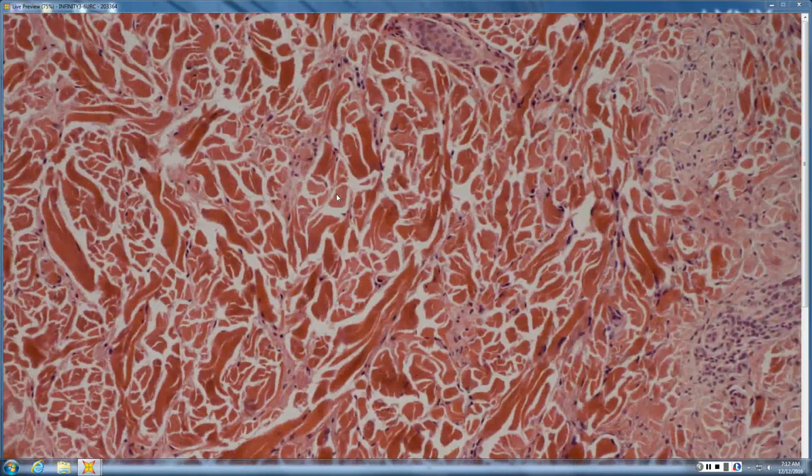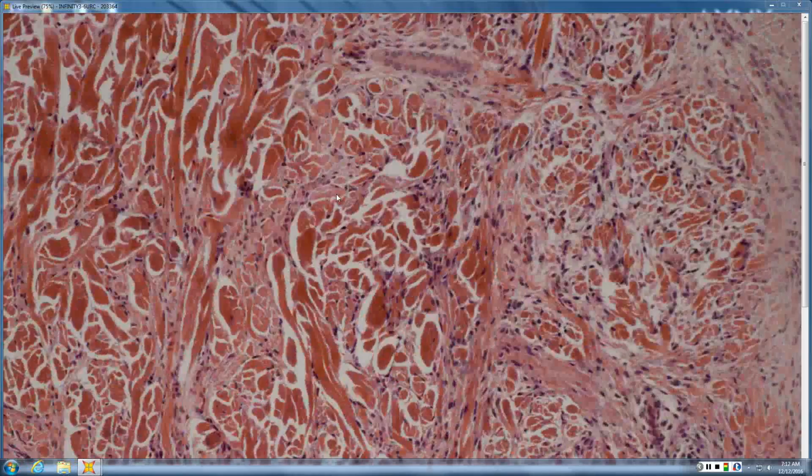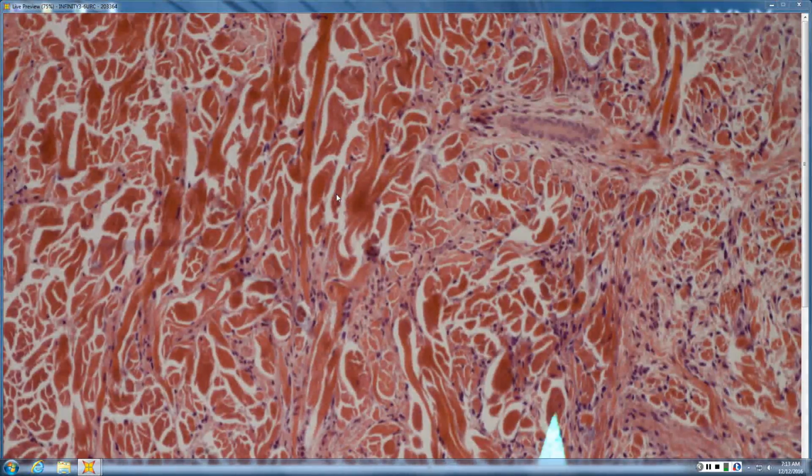They're pretty normal, but you don't think there's a bit too much space running through here? They're a little widened. They usually are more closely packed together. And over here, you definitely have a busy dermis. There are too many cells in there, and they're not inflammatory cells. These probably are around the adnexal structures, but all those intertwined in the interstitium are not. So, busy dermis, widened collagen, thickened biopsy. What are you thinking?